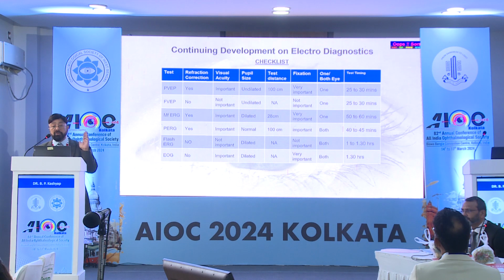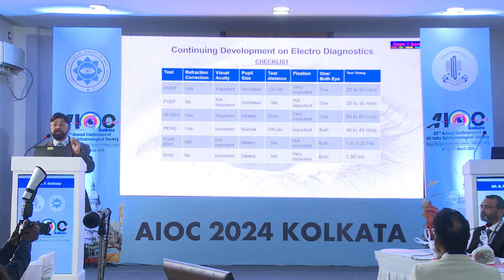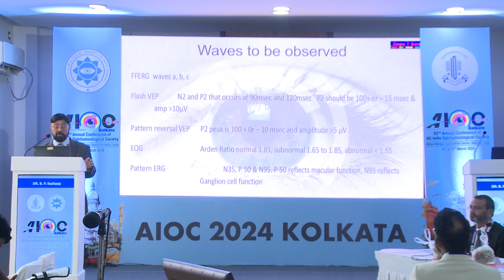In cases where fixation is important, the pupil should not be dilated, the refraction should be done properly, and the patient should have good vision. If the patient does not have good vision, go for the VEP instead. Dr. Didi will be talking about all this.